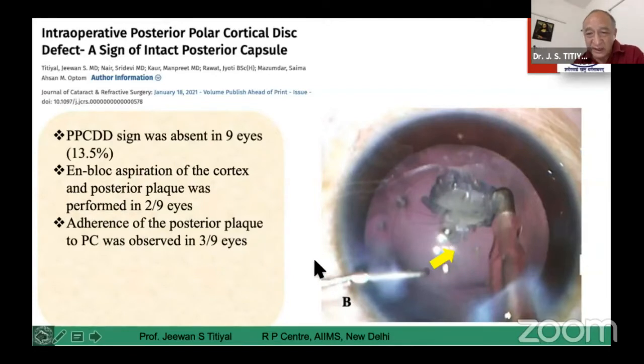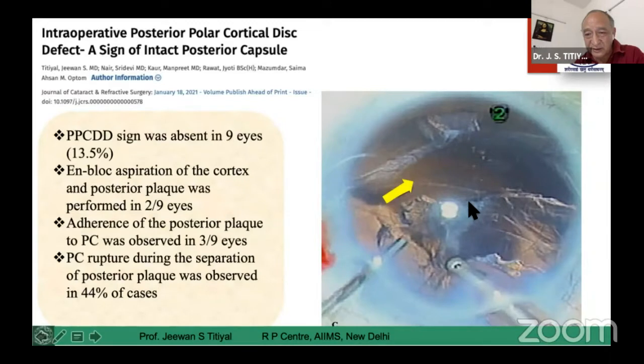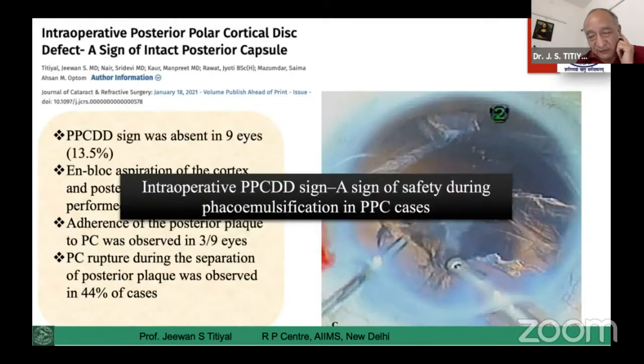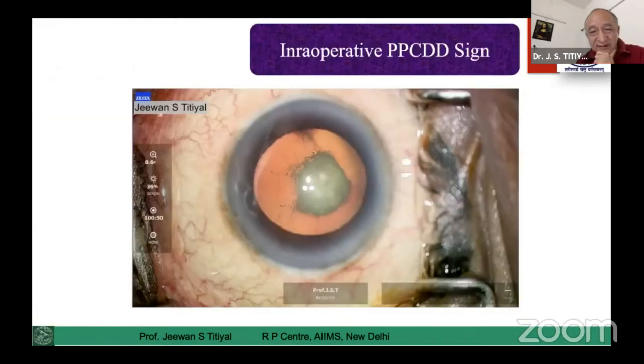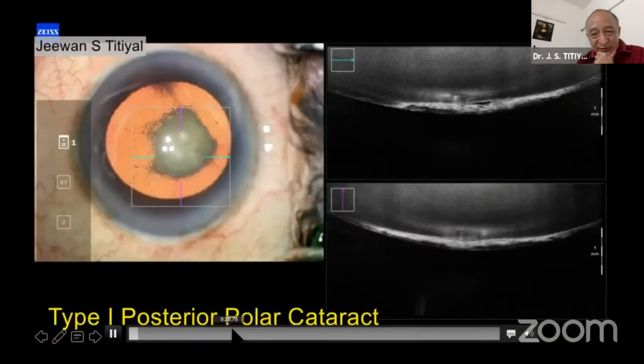You can see the stress line coming to the posterior capsule — this indicates that it would have a dehiscence of the posterior capsule. You have to be very careful; you can see an elliptical tear coming up in these cases. In the nine cases where we didn't see the disc defect sign, three patients had a posterior capsular dehiscence. So if you can see the disc defect, it is a sign that you are in safe hands.